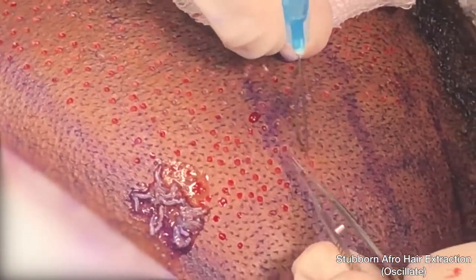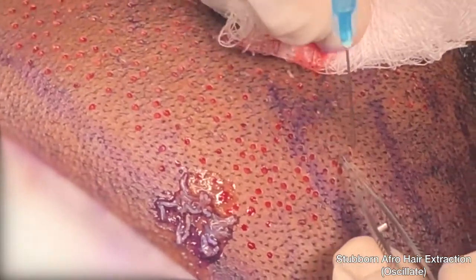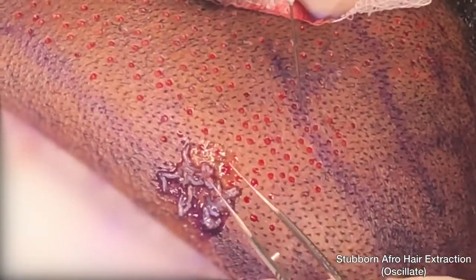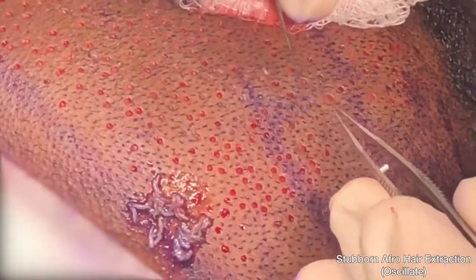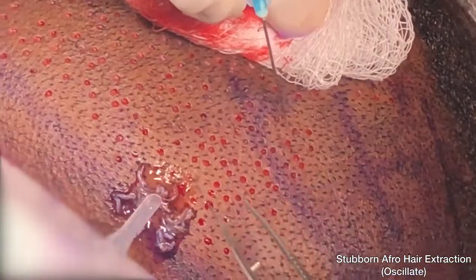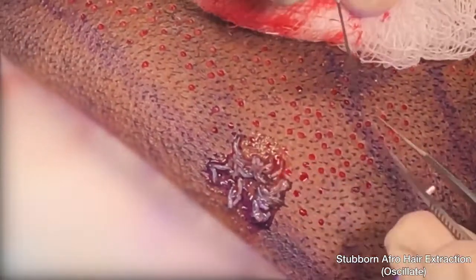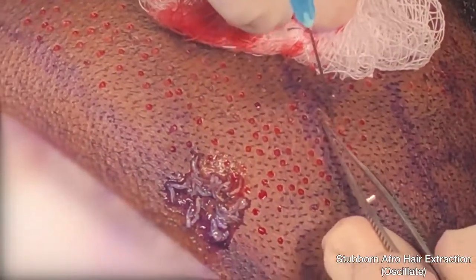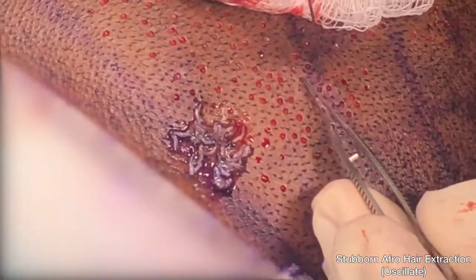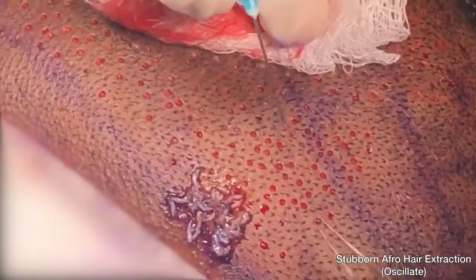For the first time, people of African heritage can now enjoy the boon of what we call FUE. Previous to the Dr. U Graft Revolution, this patient population was forced to take their chances with inefficient FUE procedures that mostly resulted in high graft damage rates, or forced to resort to strip-type surgery, which results in a linear scar on the back of the head. This is ironic because this is the demographic of all racial groups in the world that prefers to shave their heads, and until Dr. U Graft came to be, we didn't have a consistent, efficient FUE system for them. They were forced to resort to strip surgery, ending up with lines of scars on the back of their heads, which precluded them from shaving their heads.